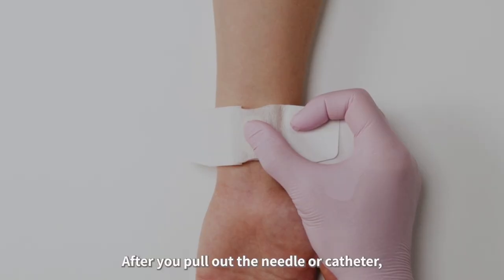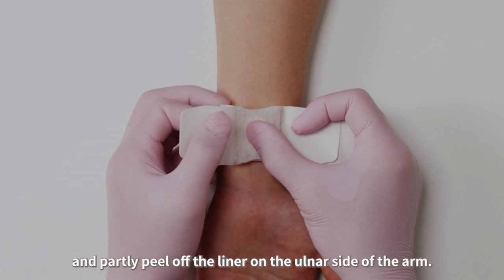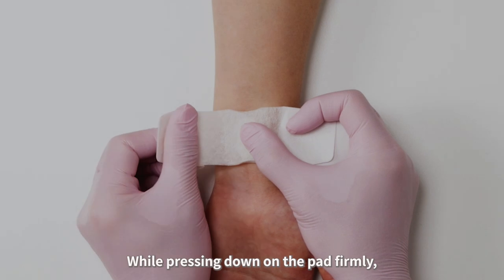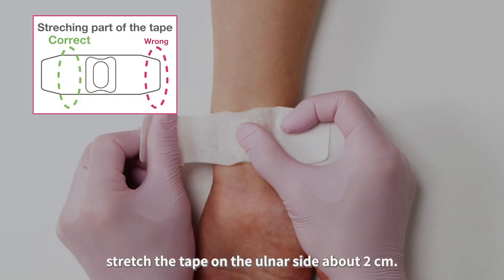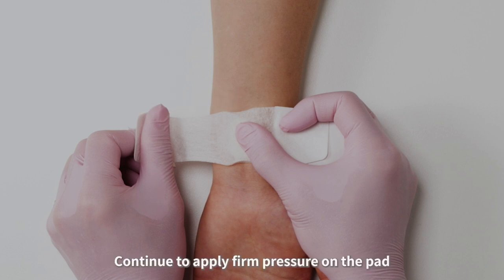After you pull out the needle or catheter, immediately put firm pressure on the pad with your finger, and partly peel off the liner on the ulnar side of the arm. While pressing down on the pad firmly, stretch the tape on the ulnar side about 2 cm.